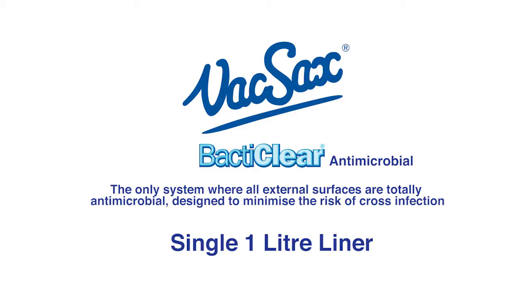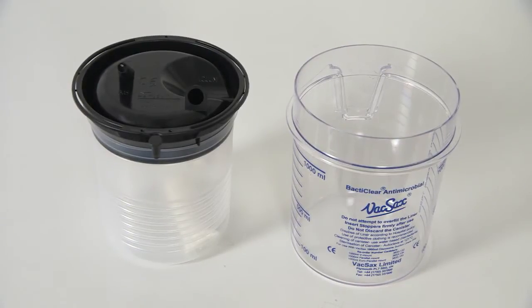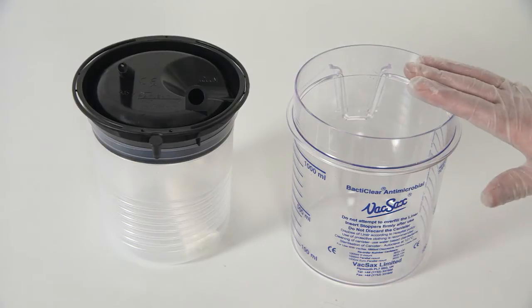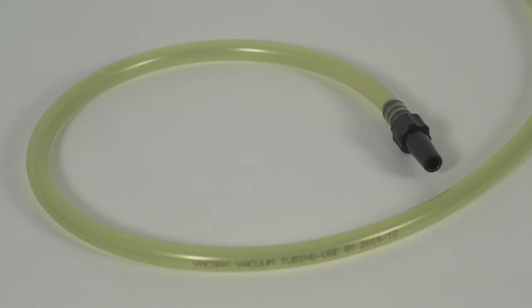The single 1 litre liner. For this you will need one 1 litre standard canister, one 1 litre standard blacktop liner, and a 1 metre length of non-disposable yellow vacuum tubing kit.